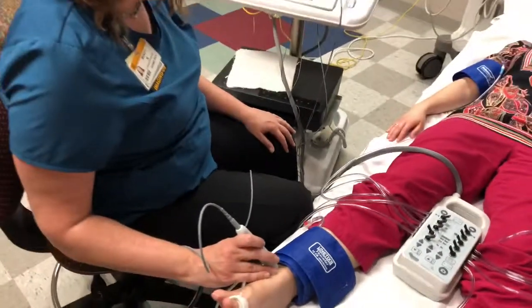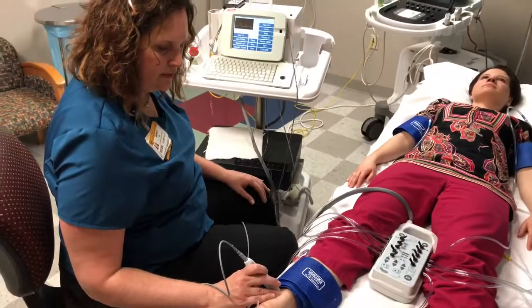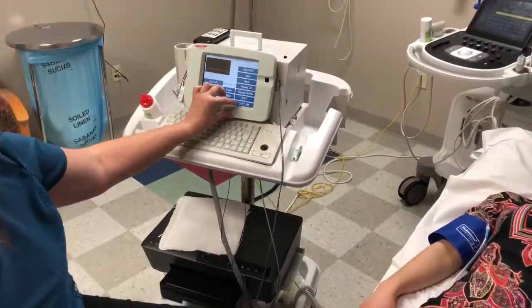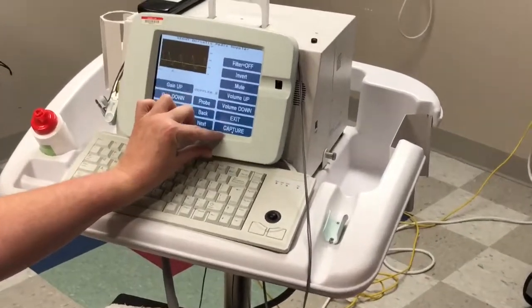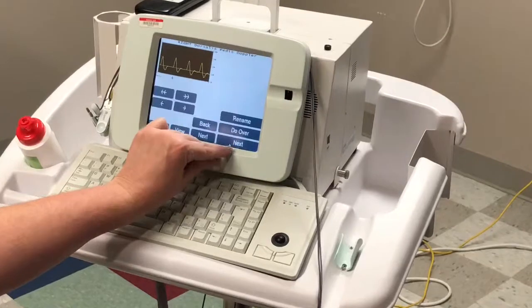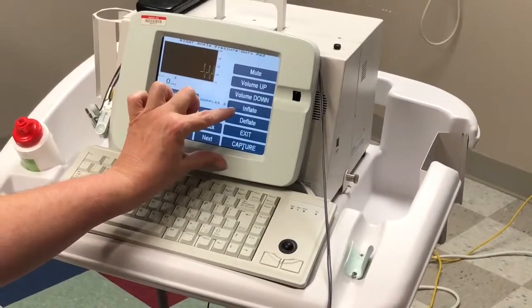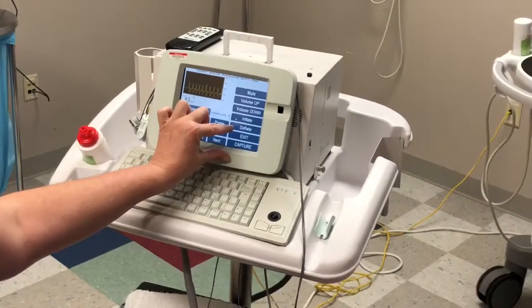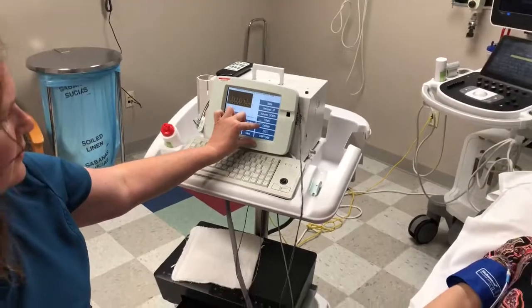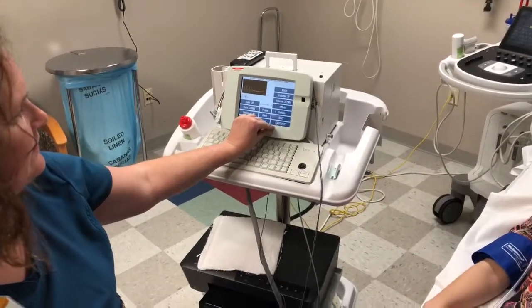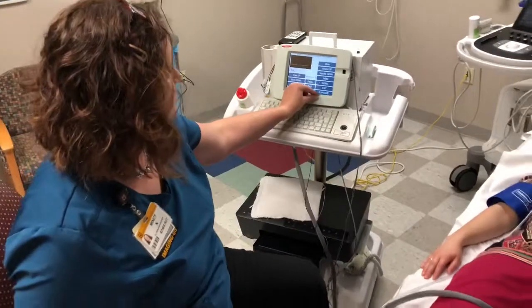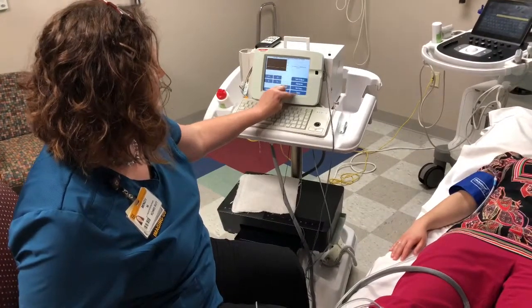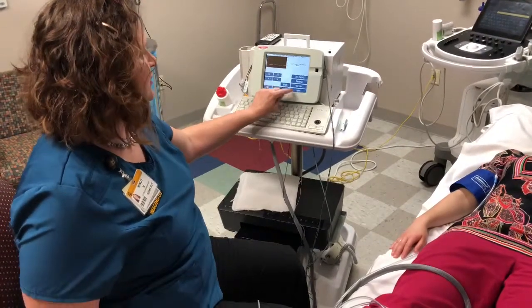The DP pulse at the ankle is just lateral at the very mid of the ankle. Try to get the best waveform you can and then hit capture, then next — it is ready to get the pressure. The pulse goes away, you hit deflate. No need to wait for it to squeeze harder. Then the pulse comes back, hit capture, and then hit next.